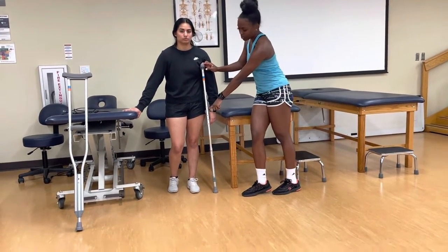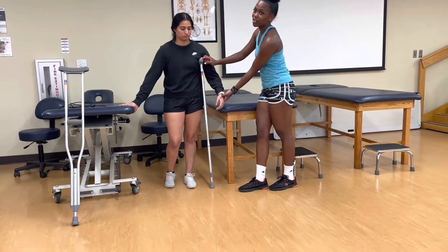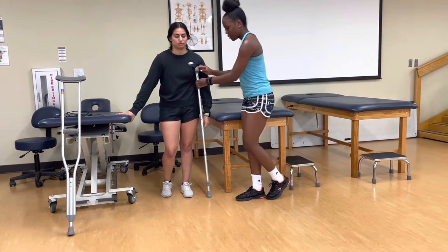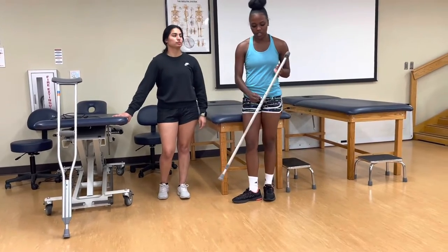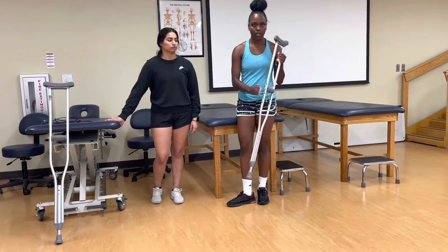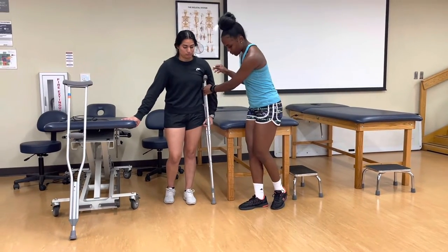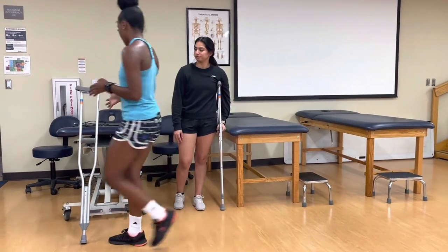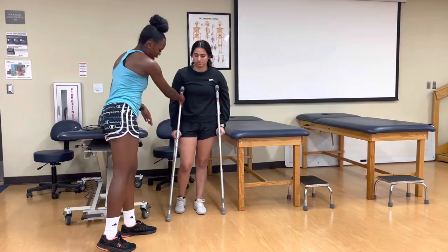Have the patient relax their arms to the side, not grabbing on anything. We want to measure the hand grip — what we're looking for is that it meets the flexor crease of the wrist. This is also pre-measured, but if you need to bring it up or down, there's a little butterfly nut that you would unscrew, pull it, screw out, and adjust accordingly. Then we do the same thing on the other side and make sure that they're even.